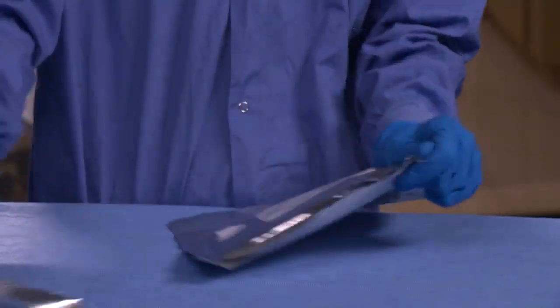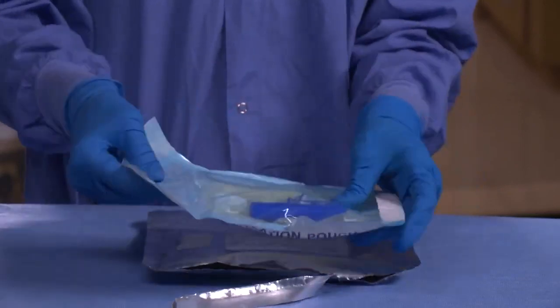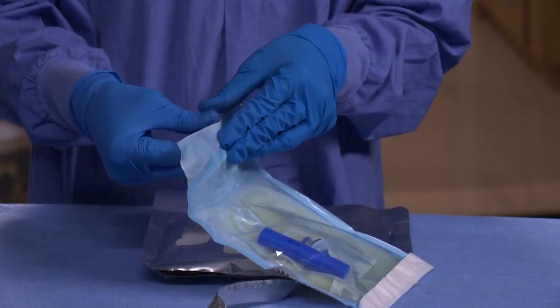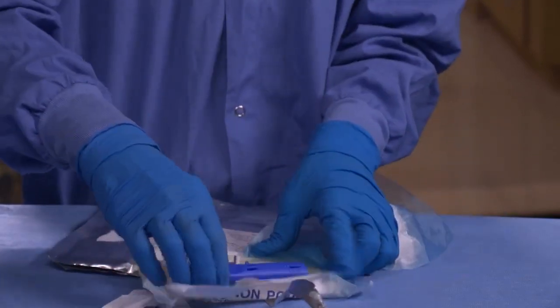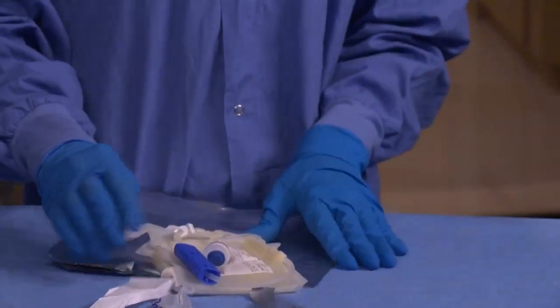Take the collection bag out of the foil cover, open the plastic, and remove the collection bag. The bag can be taken out of the foil cover and placed on the delivery table prior to delivery.